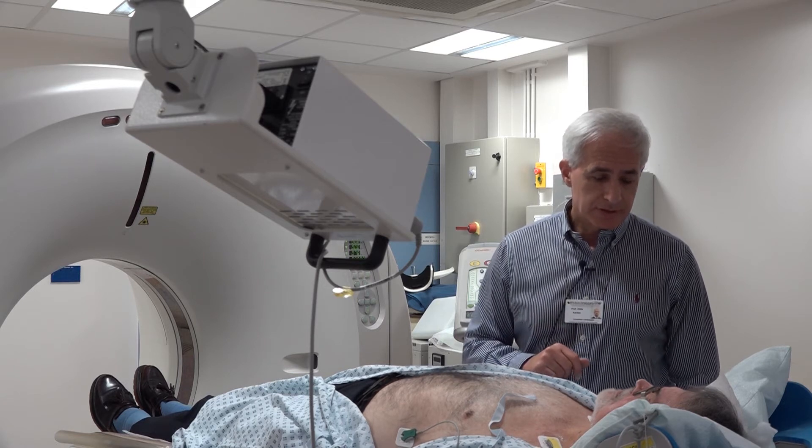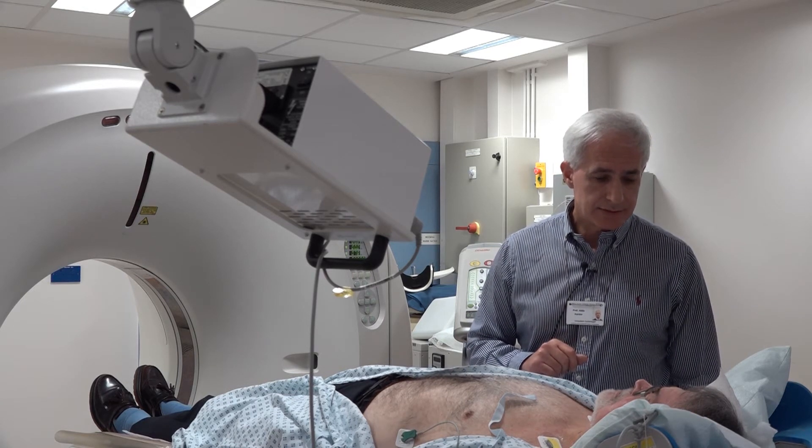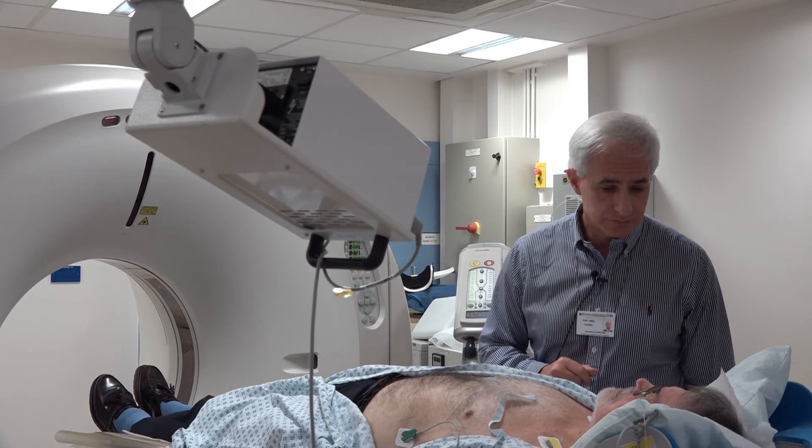This breath hold will repeat itself probably four or five times within the ten-minute scanning time. In between the breath holds, you just breathe normally as you would do.